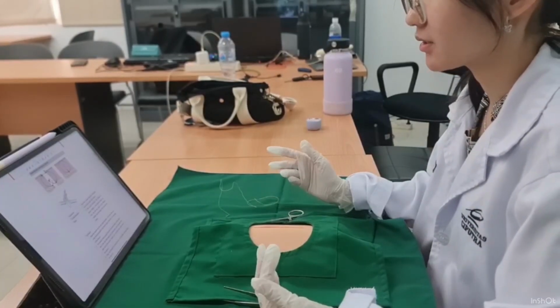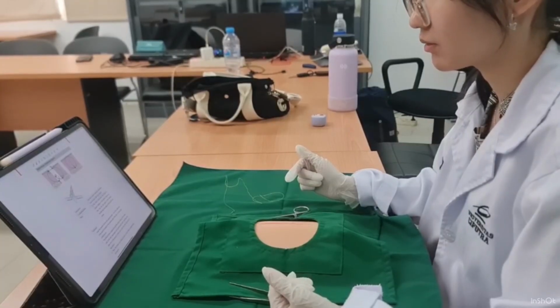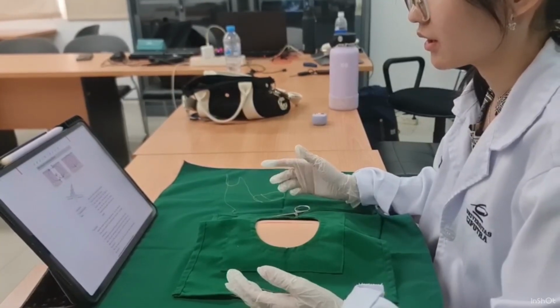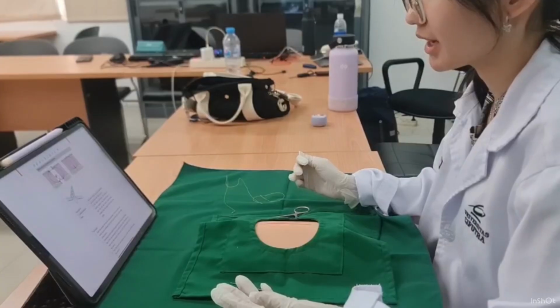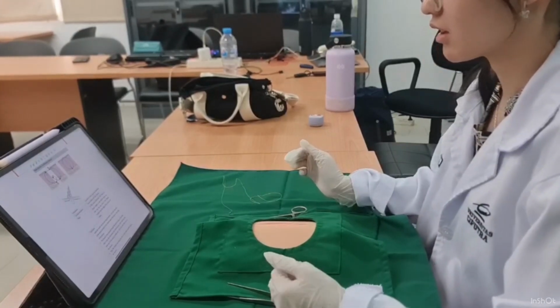And then it will be passed through the dermis tissue of the other side alternately and continuously until it reaches the other end of the wound. And then the suture or the thread will exit 1 or 2 cm from the other end of the wound. So therefore the thread will run along the skin on both sides parallel along the wound. Okay, I will start.